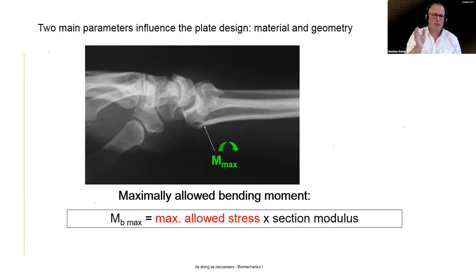And to be honest with you, this is an important thing, because the last thing you would like to have is obviously to have a good bone healing, but gliding tissue not able to travel across the metal surface. So therefore it's more of a surface treatment aspect that we need to concentrate on. Happy with that? Good. I hope so, at least, because we have to continue.